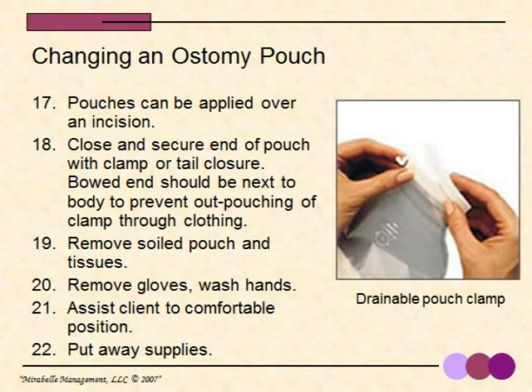Remove the soiled pouch and your tissues, remove your gloves, wash your hands, assist the client to a comfortable position, and put away your supplies.